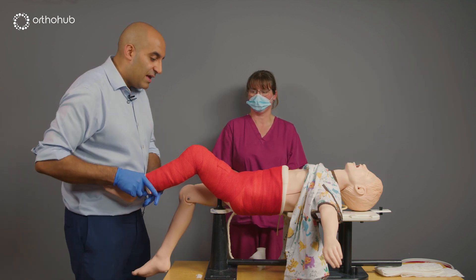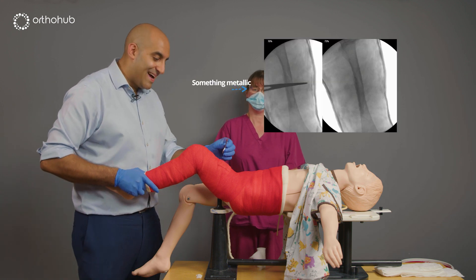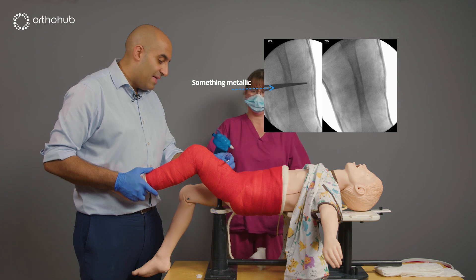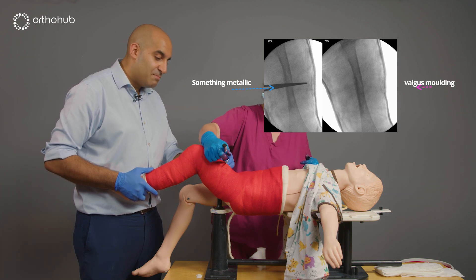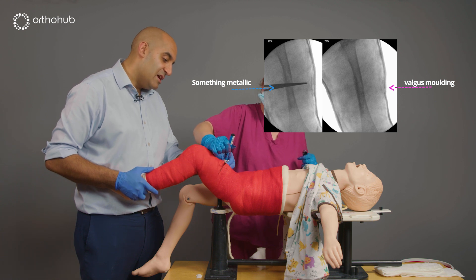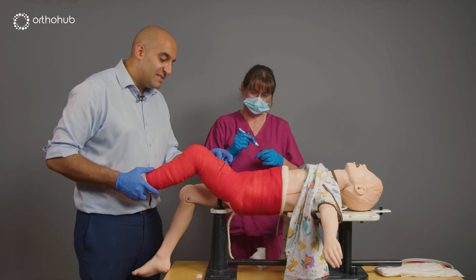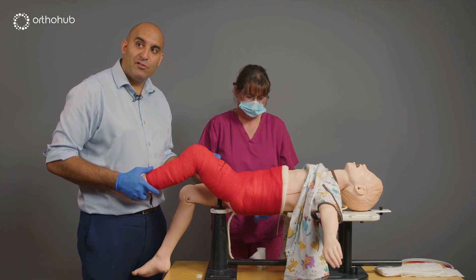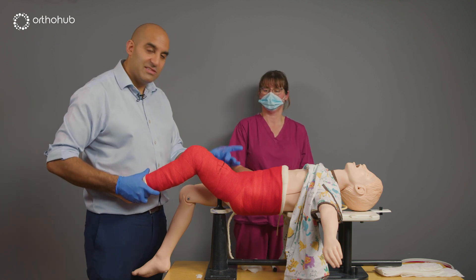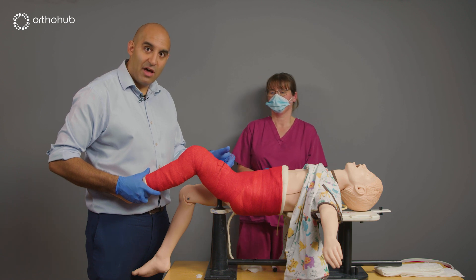The final step is to get your X-ray machine in, use something metallic to mark the cast at the level of the fracture, extending medially towards the groin. This is the area where you'll need to wedge the plaster at seven to ten days if required — usually because the fracture is drifting into varus — and the wedge is applied on the medial aspect of the thigh.